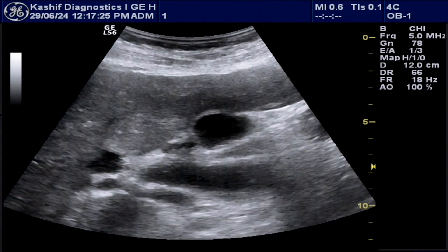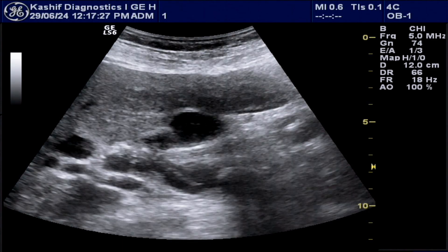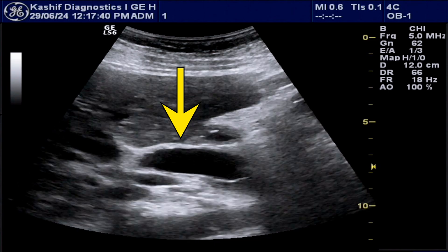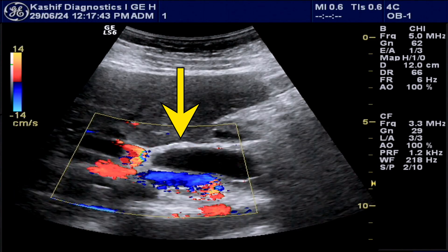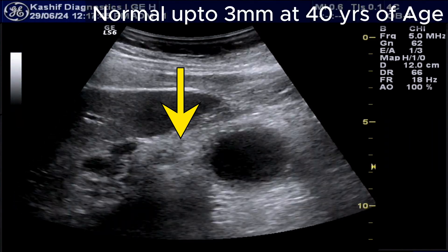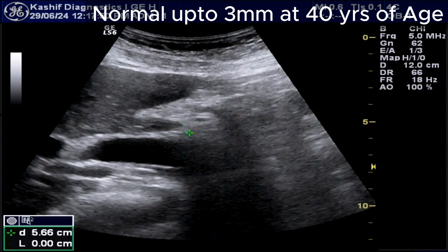This is the CBD. The CBD is anterior to the main branch of the portal vein. As we see, the CBD is grossly dilated — this measures 13.3 millimeters.